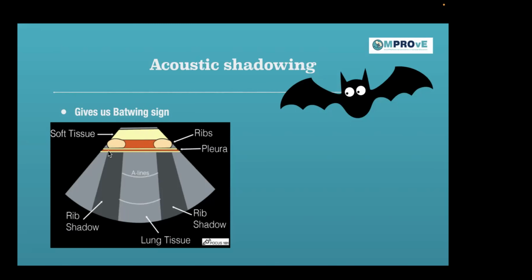Bone being highly reflective, it reflects 100% of the waves back to the probe. So you see bone as a very bright line, bright image, but anything beyond bone will be lost. So that's a shadowing because your sound waves are not penetrating through the bone. So it's 100% reflected back. So there's nothing to show beyond the bone. So that's a rib shadow. And then here will be your pleura, and through the pleura, because there is air here, your ultrasonic waves will always reverberate horizontally and give you the A lines.